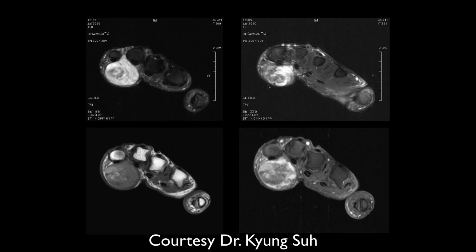The axial images, again, demonstrate T2 or STIR hyperintensity, maybe some internal septations, and it's definitely a heterogeneous lesion. Again, fairly well demarcated. At this point, it looks like there is some mild interdigitation into the fourth and fifth rays, but the cortex of the bone, at least at this level, appears to be preserved. It doesn't look like it's really invading or causing erosions there.